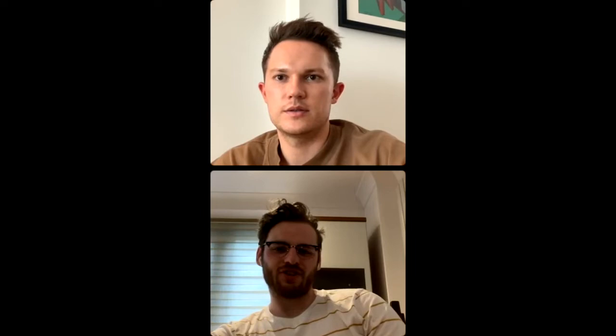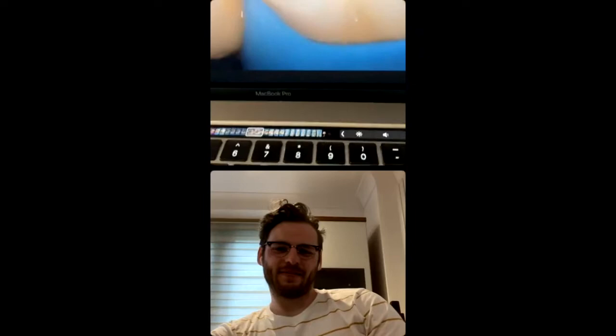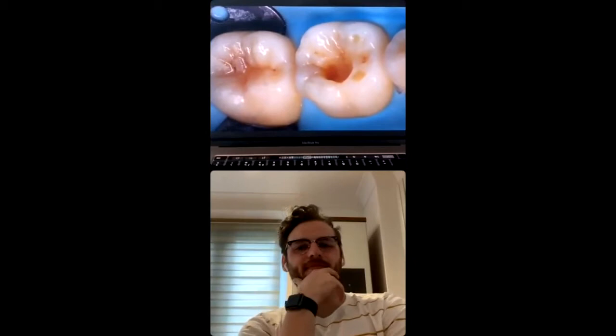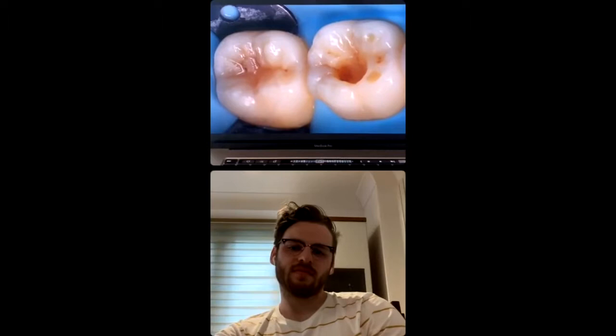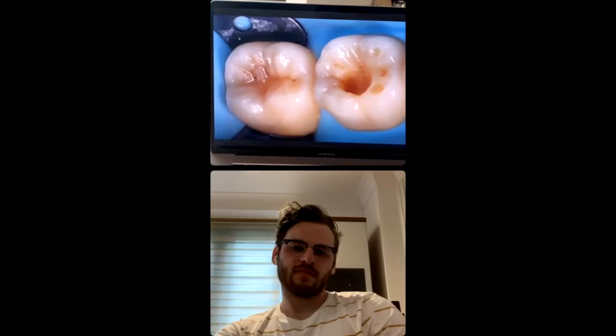Let's jump straight into a case. This patient had a composite restoration which had fallen out. You can see some decay, and there's also some occlusal decay on the 7 as well. So I'd isolate it with rubber dam — this is the clamp I use all the time. I use a heavy non-latex dam — I think it's the Unident, you get it from Dental Directory, cheapest chips. It's really nice to use and quite easy to floss in between.